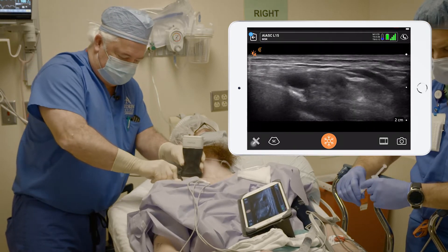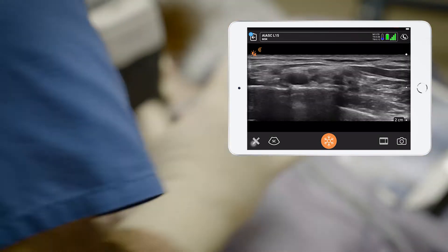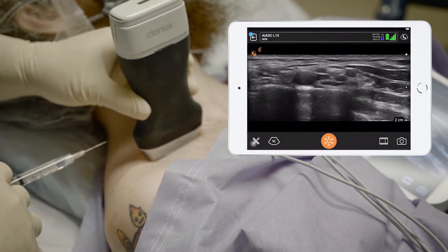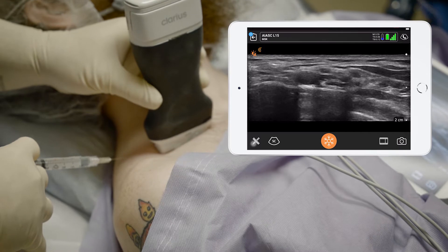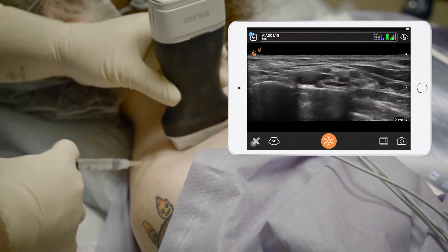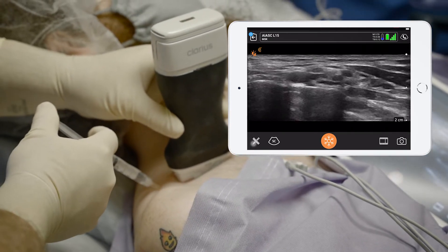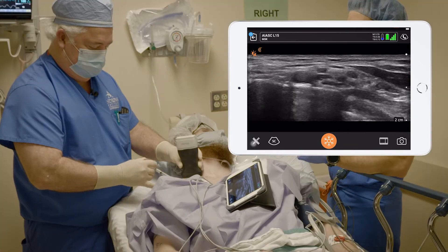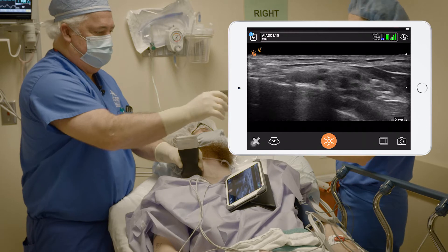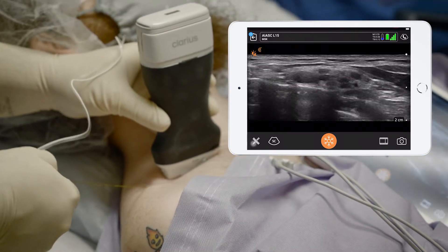I'm going to prep him up with a chloroprep. Here comes a little numbing shot — it's going to sting. On three, take a big deep breath. One, two, three. Attaboy. A little burn right here. Our local is in.